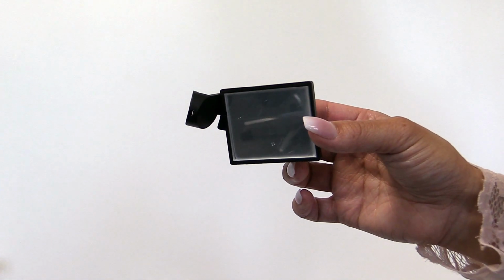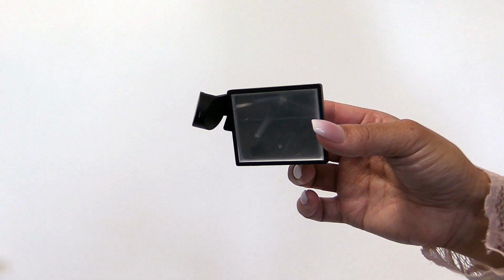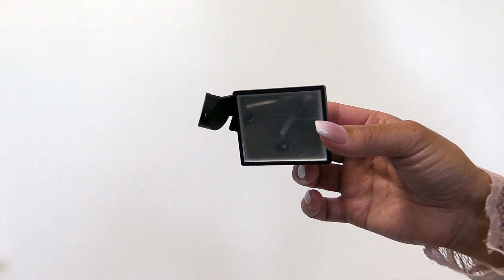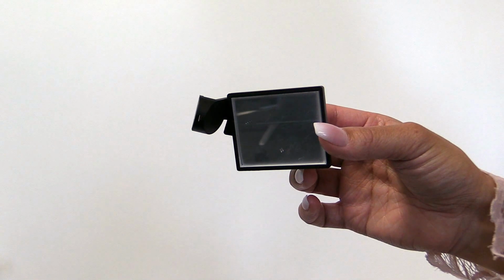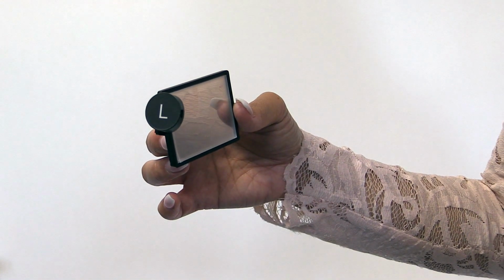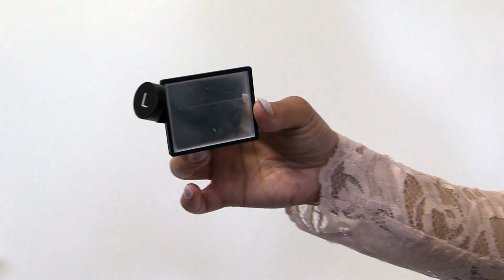For the mirrors, it is important to first note that the left mirror is marked with an L and the right mirror is marked with an R. This part of the mirror is also magnetized. The mirrors are designed to fit against the inside edge of the Observe 520.